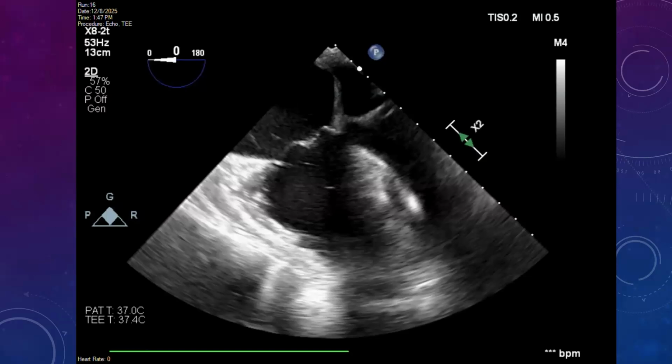So she went to sleep okay, I intubated her. My resident let me intubate, which was very kind of him. And then about 20 minutes later, my resident gives me a call. Hey, they haven't made incision yet, but our end-tidal CO2 just went from like 35 to 15 all of a sudden. That should always be a warning flag to you guys.